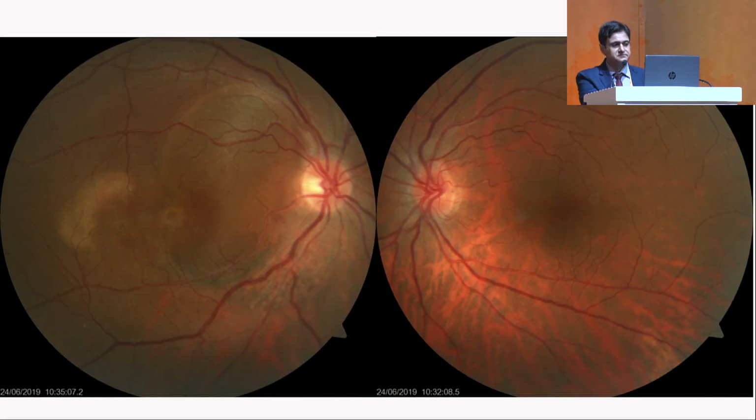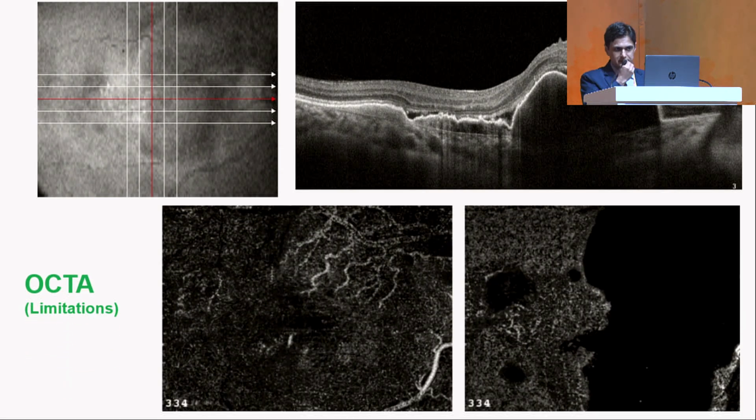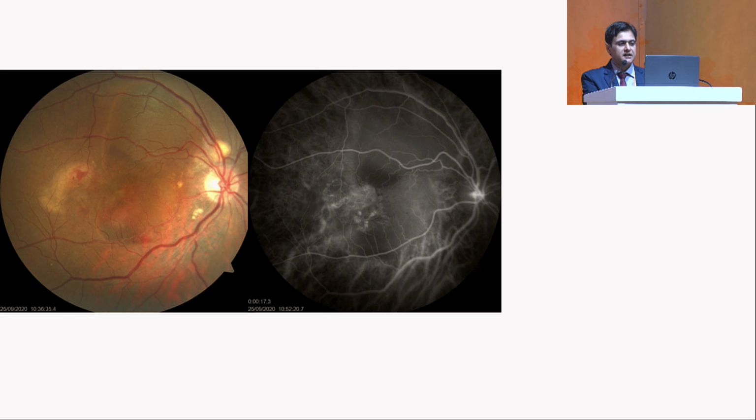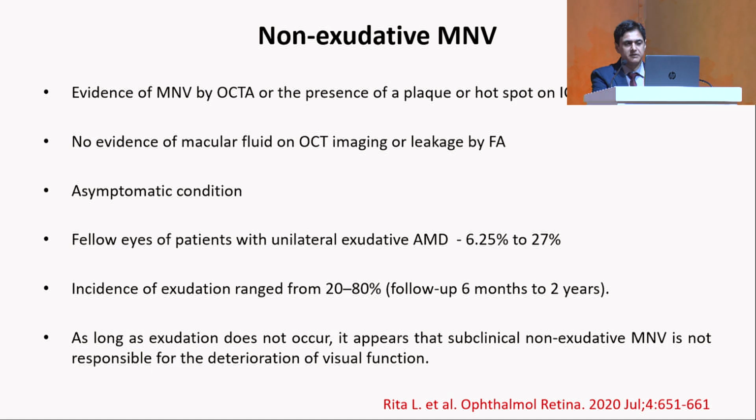Here is one patient who had a large PED and a CNVM. When I did an OCTA, I could only see a branching vascular pattern with a large PED, but no polyp could be appreciated. When I did an ICG, you can see a well-defined hotspot, a hyperfluorescent region which is increasing. I had a very high suspicion of polyp in this case, even based on the fundus photograph and examination, and that is why I did the ICG angiography, and it came out to be a polyp which was missed on OCTA.